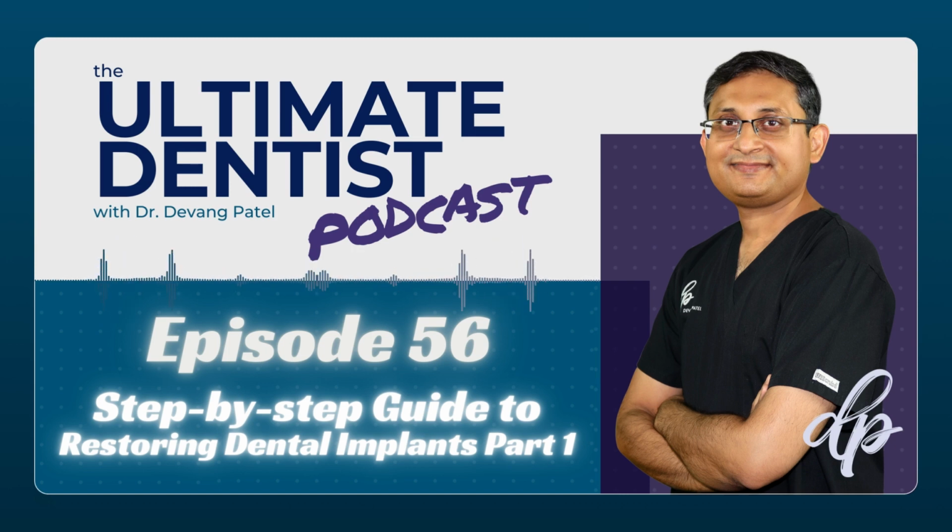But most of you won't be doing the wax-up yourselves, so you are relying on your technician to tell you. If there is anything obvious you can improve by adjusting either side of the teeth, either by adding, or sometimes, let's say lower right 6 has come out and lower right 7 has an overhanging or fractured amalgam on the mesial aspect, it's better to change the restoration. If the contact points are not nice, then it's better to make them nice and flat so the technician can close the space properly. So that's something you need to assess.